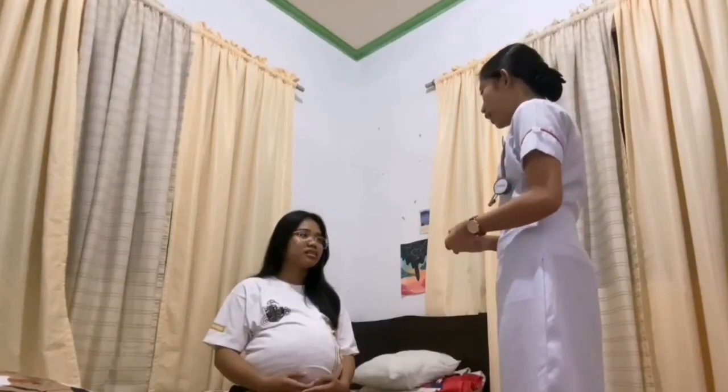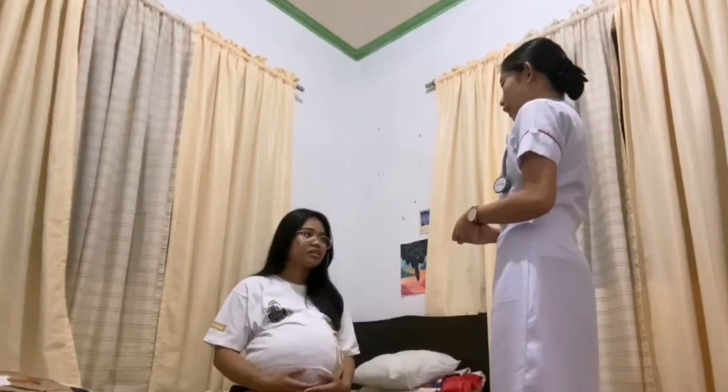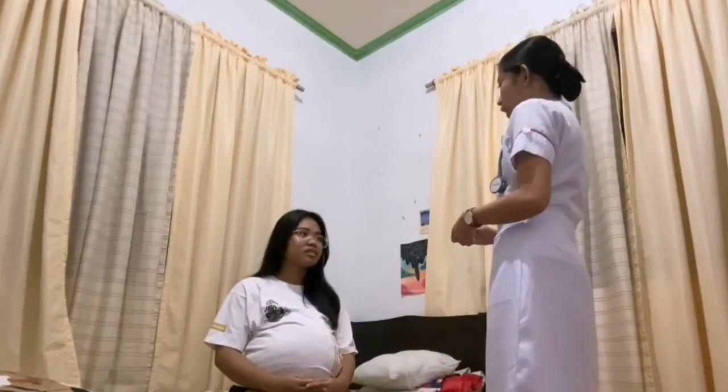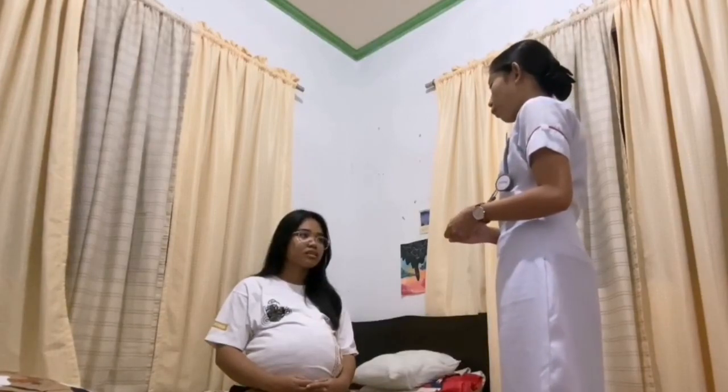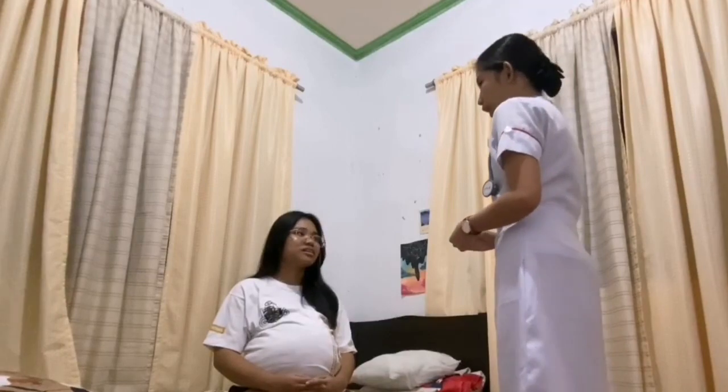Yes. In this procedure, we'll be locating the fetus as well as its position, its activity, and its engagement. See to it that the findings of this assessment will remain confidential between you and me. Is that okay, ma'am? Yes. Okay, thank you.